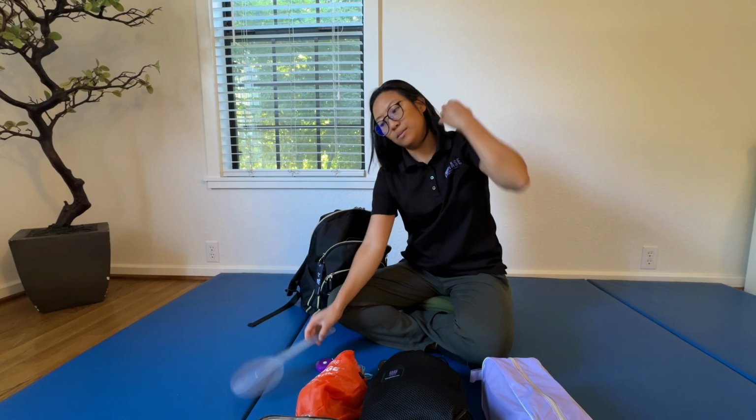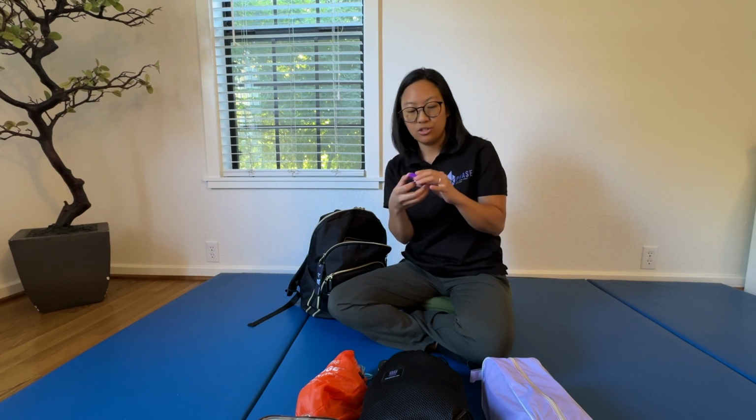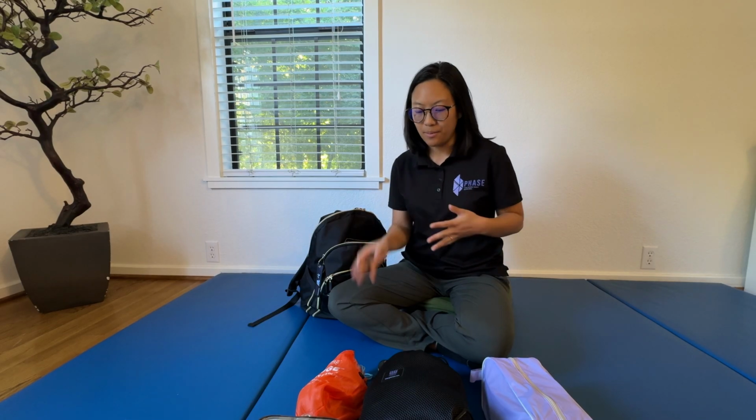Of course, goniometer, especially when I'm working with people where we're trying to improve whether it's passive or active range of motion. Tape measure is really helpful for measuring any sort of swelling in the area. I have a larger one that I'll use too if I need to measure distance on the floor. Like for example, when I'm at the pickleball court and I'm needing to measure for an agility T-test or something like that. But again, that's mostly for evaluation stuff, but I keep that in my backpack.